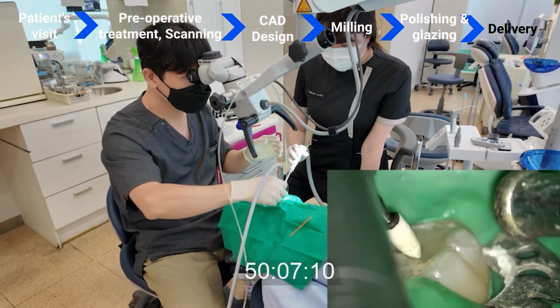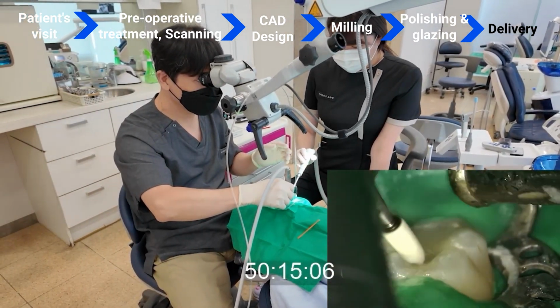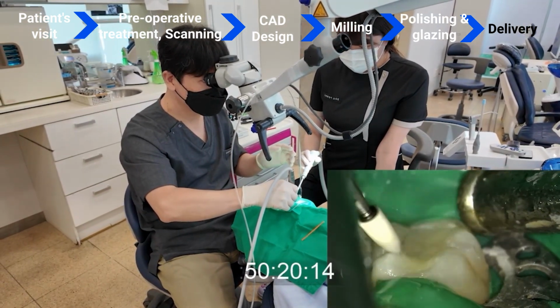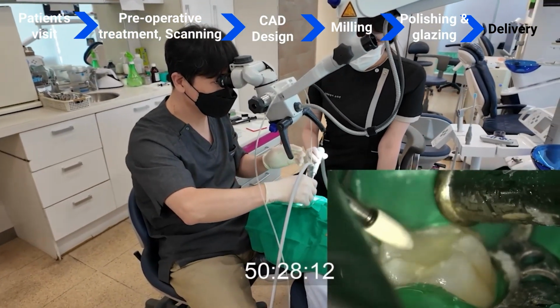Final step, polishing with a white stone burr, checking the bite with bite paper, and if everything's good, a final polish to finish off. And there you have it, a brand new inlay, all set in just one visit.